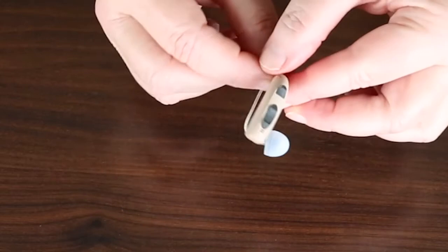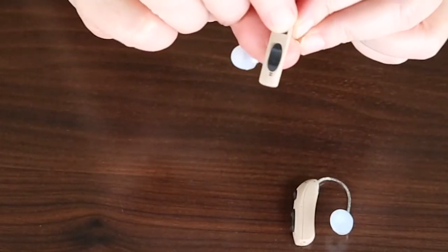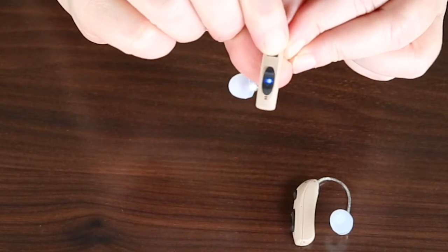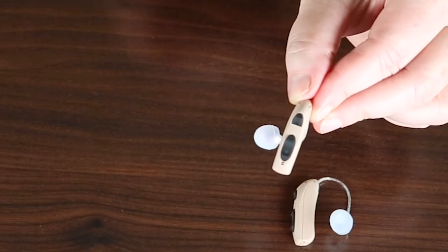When you're ready to power off the hearing aid, you'll simply do a press and hold. And at that point you will receive a blue light. Blue now means it is powered off.